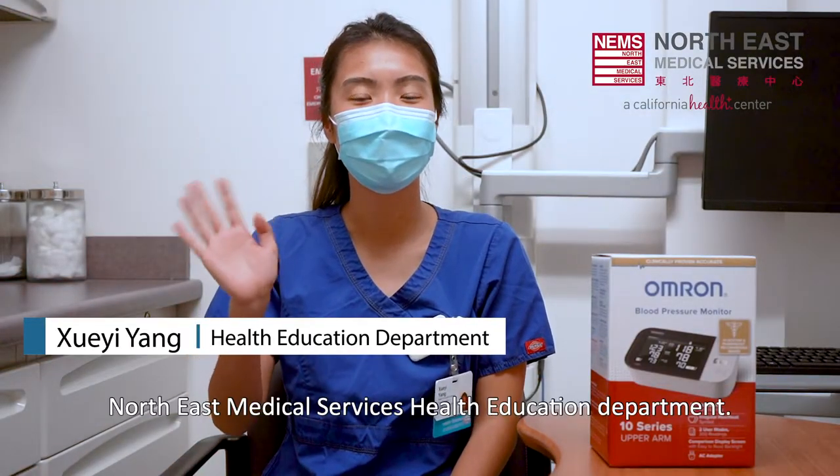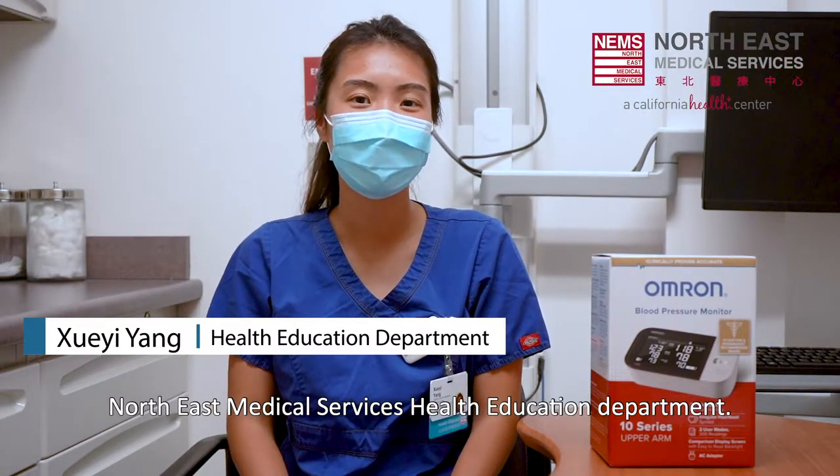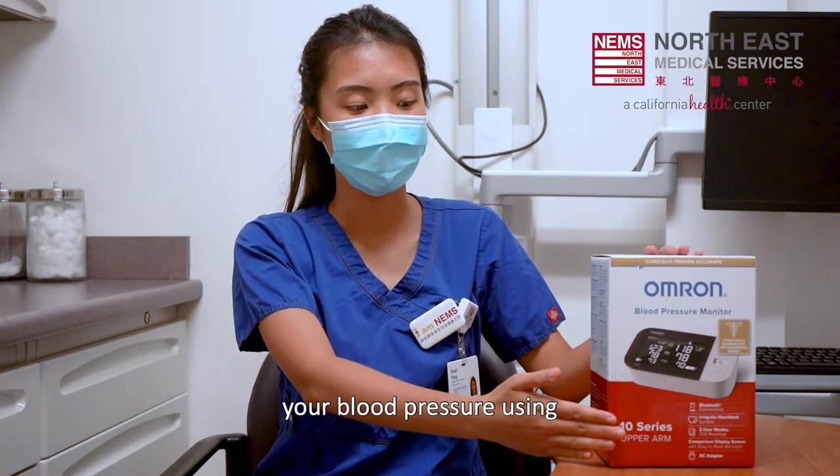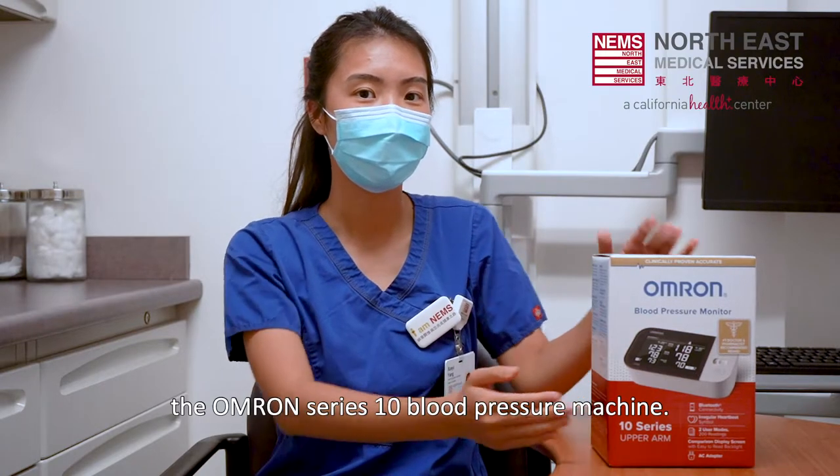Hello, I'm Xu Yi from Northeast Medical Services Health Education Department. Today, I will show you the proper way to check your blood pressure using the Omron Series 10 blood pressure machine.